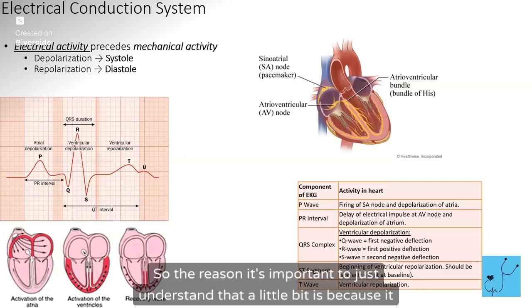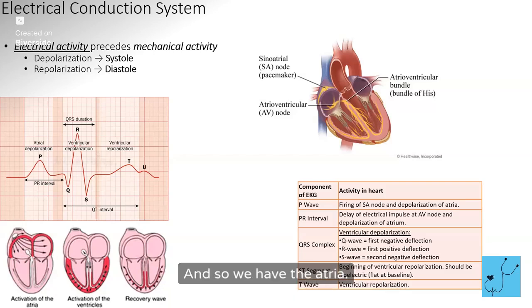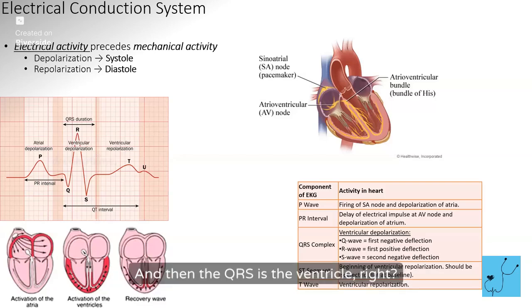So the reason it's important to just understand that a little bit is because it correlates to our little rhythm here, our waveform, okay? And so we have the atria. So when you see a P wave, I want you to think atria, or the top chambers of the heart. And then the QRS is the ventricle, right? And then we rest, okay? So with every beat, this is what we should see.